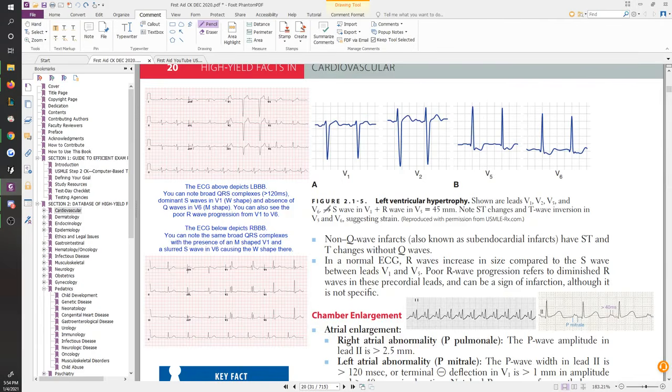So what they tell you is that there's going to be a sum of things that's going to be a problem, right? They first tell you to look at the sum of the S wave in V1 and the R wave in V5. That's going to equal 45. That's what they're saying here. That bit of knowledge doesn't really mean too much, in my opinion. It's not something so easy to evaluate, nor is it something that you'll truly be using to evaluate left ventricular hypertrophy in the clinical setting.